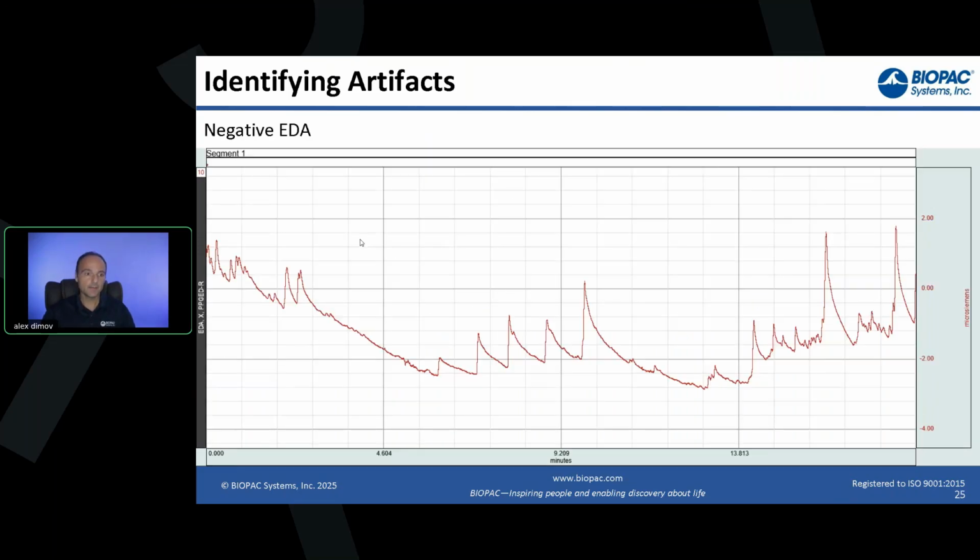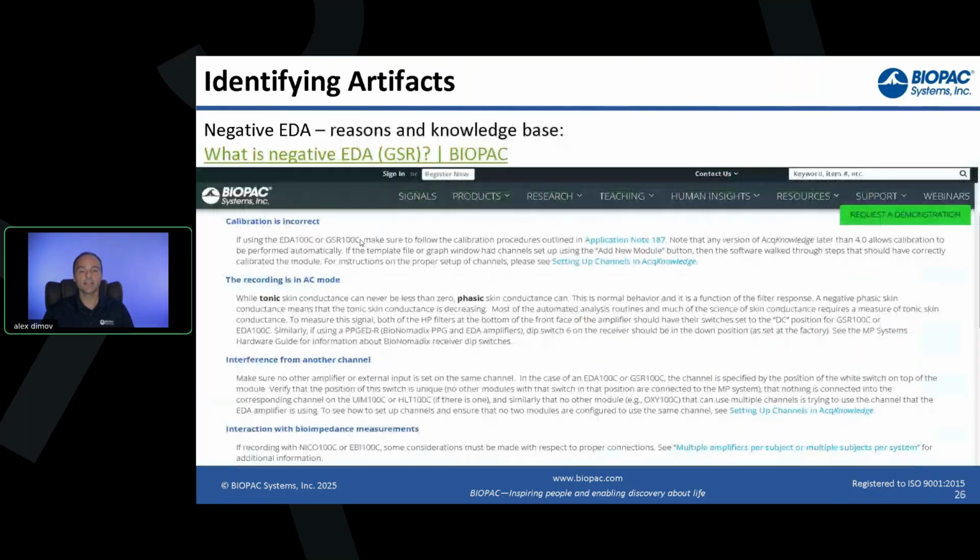And then you have negative skin conductance, which comes up every now and then. People ask why they're getting negative skin conductance. Well, first of all, you cannot really get negative skin conductance. This doesn't exist.